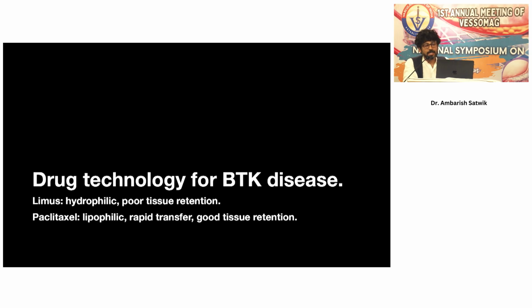Drug-eluting stents come first, and our learning from drug-eluting stents was as follows, and in animal studies, that vascular smooth muscle cells start to hyperproliferate within 24 hours.